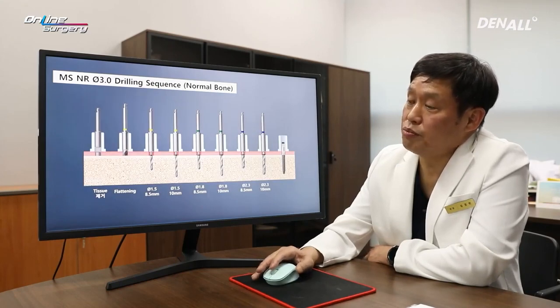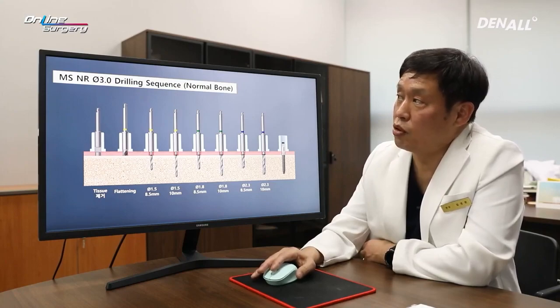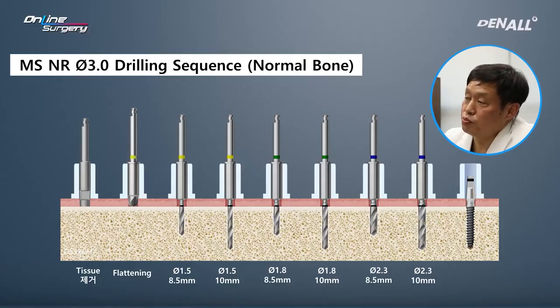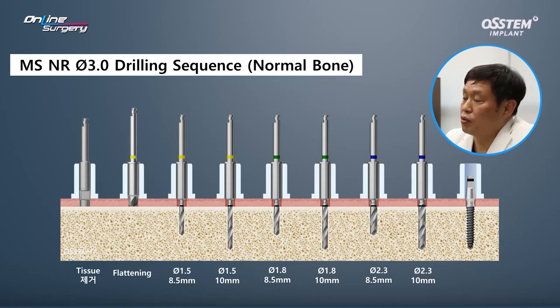I'm going to place a 3.0 MS implant, and this is the sequence for it. Although I did socket preservation, I consider this as normal bone. I did a tissue punch. If there is a slope, I use a flattening drill. For the initial drill, I use 1.5 by 8.5 first. For double contact, I use 8.5 first, and then use 10 mm. If necessary, I can use 1.5, 1.8, and then 2.3. But if I do initial drilling using 1.5, I can skip and use 2.3 without experiencing a major problem. Depending on the case, if the bone is too hard, you can also use 1.8. By doing this, you'll be able to place the MS implant more safely.